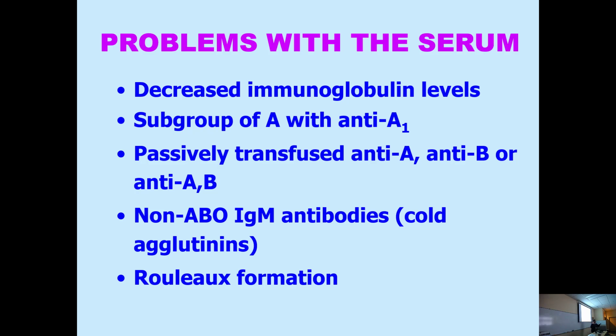We think that's what was happening last week with the A cells, because we were running the A cells, remember, all the way through like a panel, and they were all positive. We think those A cells had Duffy antigen on them, is what we think happened with that. So usually in the lab, you go back and you get a different A cell and you run it with a different one, and we just didn't have a different one to run.